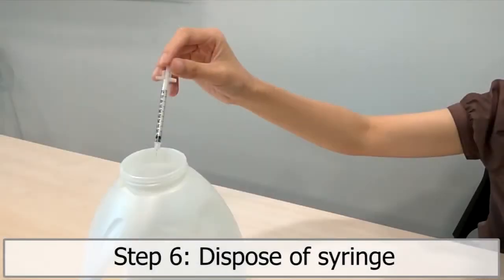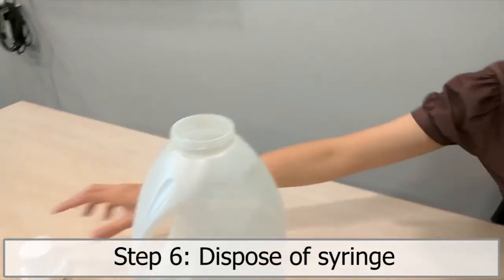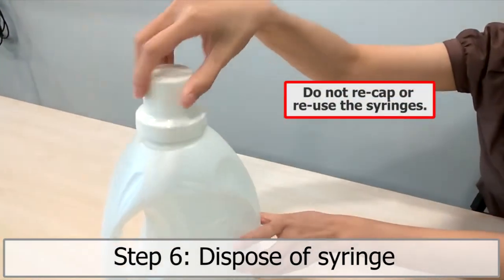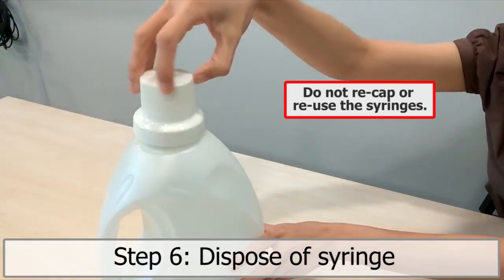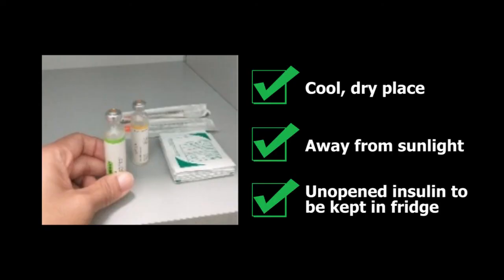Step 6. Dispose of syringe. Throw used syringes into a hard plastic container with a cover. Do not recap or reuse the syringes. Keep opened insulin in a cool, dry area away from sunlight. Unopened insulin must be kept in the fridge.